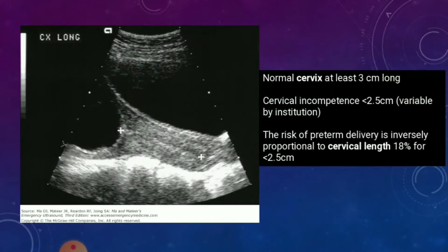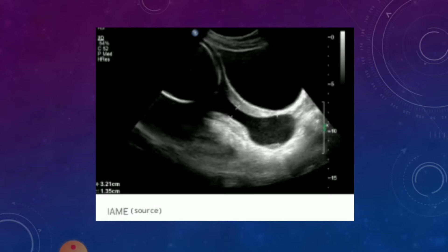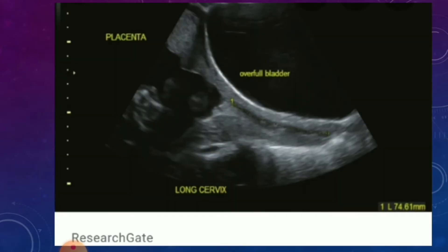You want to begin in the lower uterine segment of the scan to see the cervix, see whether the cervix is the correct length. Cervix usually above 3 to 3.5 centimeters is normal. You want to make sure there's no cervical incompetence, the cervix is not shortened, or there's funneling of the amniotic membranes into the cervical canal. A pitfall here would be an extremely filled bladder, which can cause false elongation of the cervix and can mask a cervical incompetence.